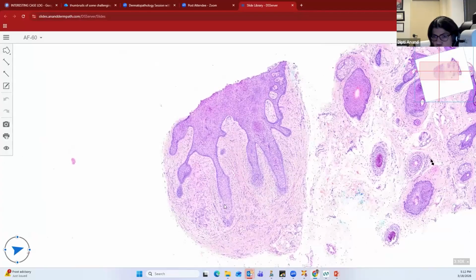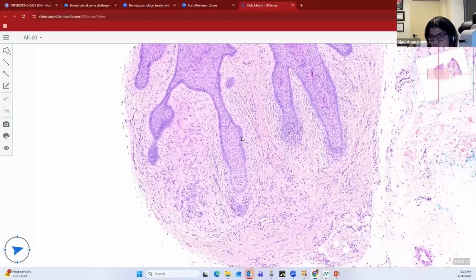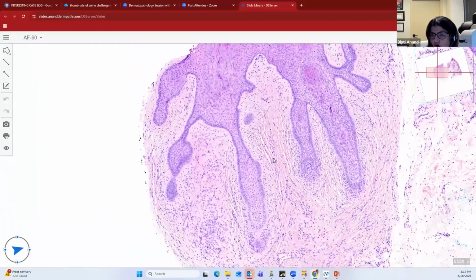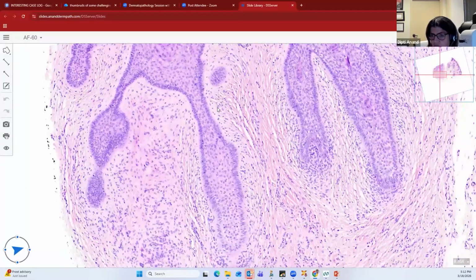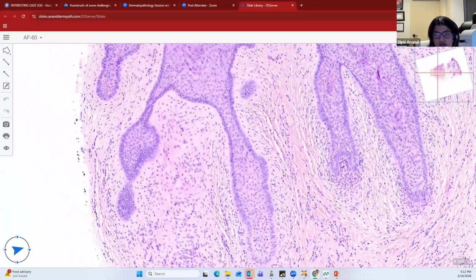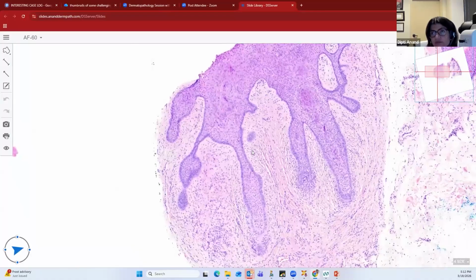You can see these immature strandy follicular epithelial islands, these really thin follicular epithelial islands, which are thin cords, closely interacting with this pink stroma, which often looks like a neurofibroma-like stroma. So it is very pink. It has these delicate spindle cells, but it's not really a neurofibroma-like stroma. It just looks like it. So these thin, strandy follicular epithelial islands are interacting with this pink stroma.